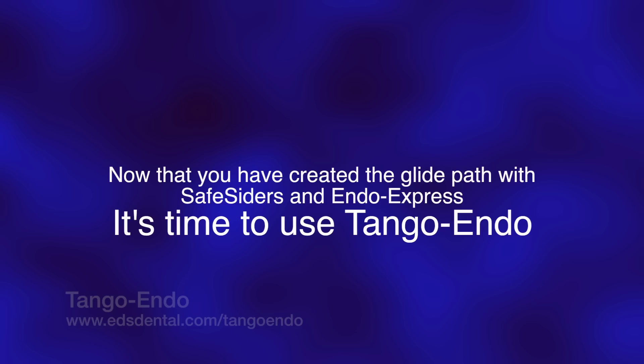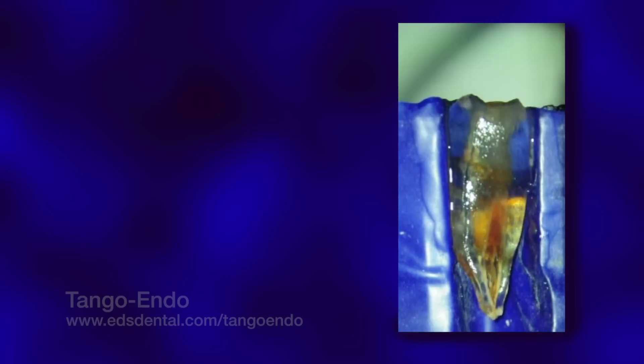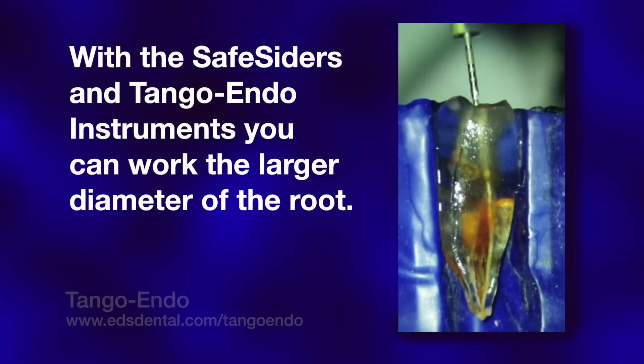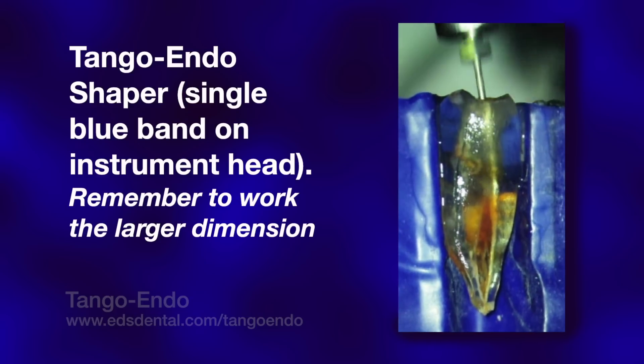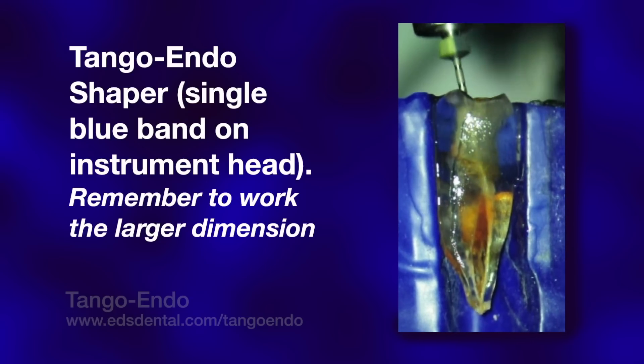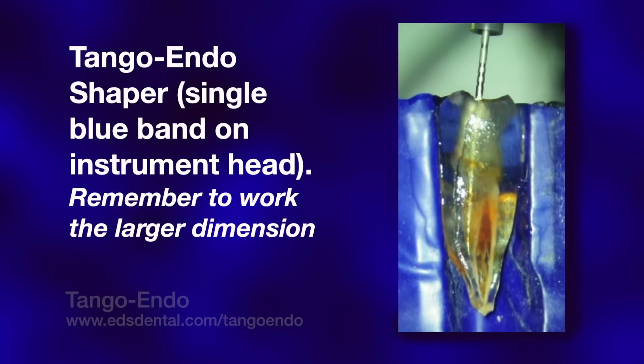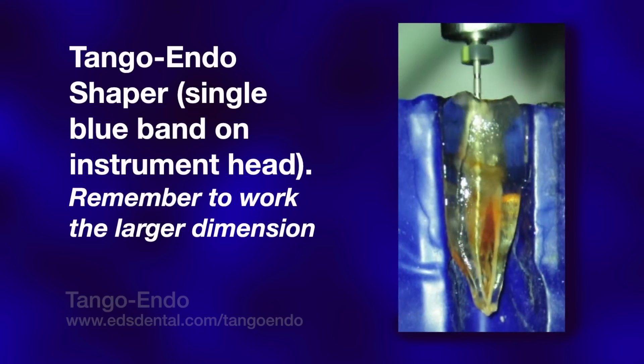Once the canal is properly widened in both planes with the 20-02 modified safe-sider in the 40-45 degree reciprocating handpiece, we are ready to switch to the two Tango-Endo instruments that have the ability to cut more aggressively in the buccal-lingual plane, again without fear of instrument separation. The Tango-Endo instruments consist of a shaper and a finisher and are used in a latch-type 45-degree reciprocating handpiece oscillating at 3,000 to 4,000 cycles per minute. As noted by the obvious slurry they create, they are designed to be more aggressive in removing dentin in the buccal-lingual plane, and are vigorously applied to the buccal and lingual walls.